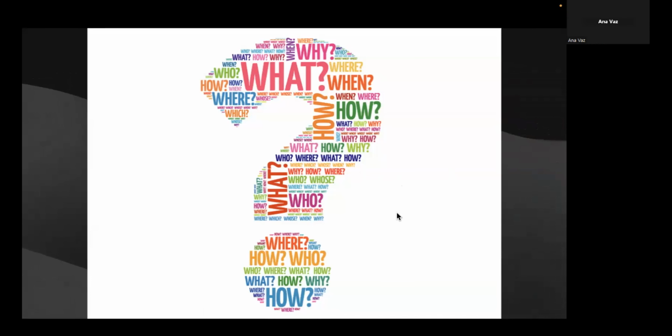In the longitudinal view. You mean cranially, craniocaudal? Yes. Cranially I have B lines, and caudally I have A lines. Okay. It's not usual.